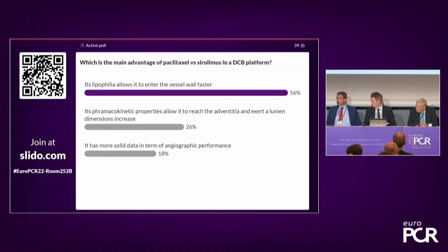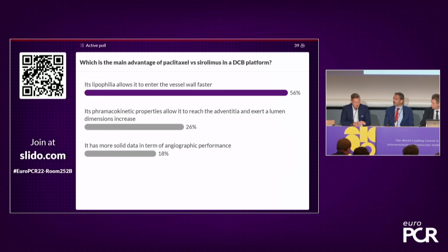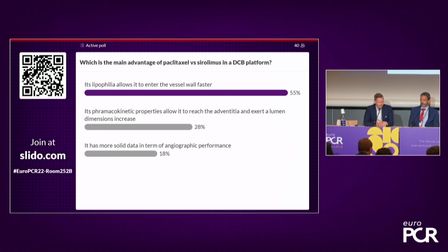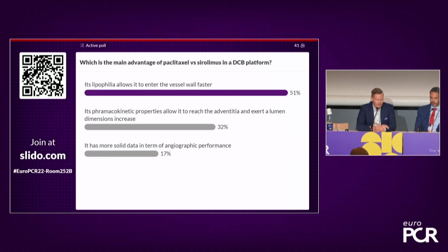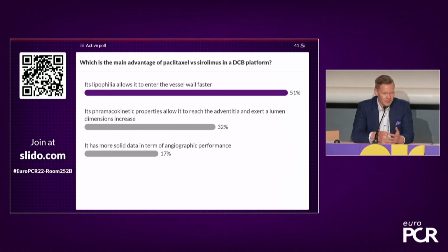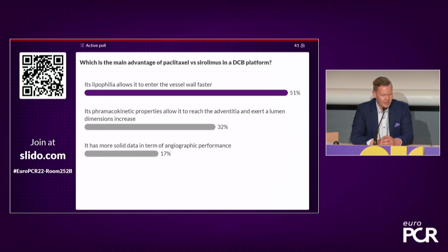Yeah, it's a good question. We don't measure any specific time, but if it takes 4 minutes or so, we take a fresh balloon. And I think there are also differences between balloons. Some balloons tend to scatter their medication from the surface. And it's very important that you have equipment, guideliners, 2 wires, to make it quick to the lesion.